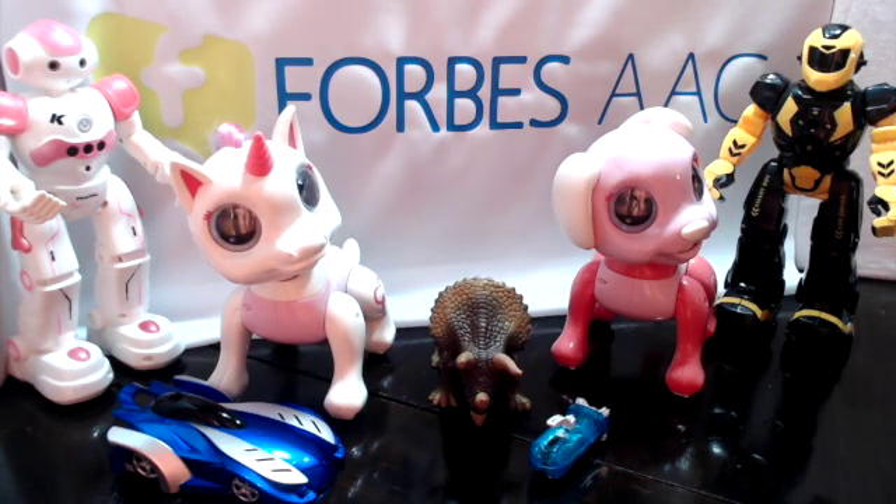Hi, my name is Bridget Gillermini and I'm an Assistive Technology Specialist with Forbes AAC. I want to share with you some of the infrared toys we've been exploring here at Forbes. We've paired the IR commands of the toy actions to grid sets on our new WinSlate, which features an Adapta Hub with built-in infrared. There are other infrared toys you can use with the Forbes WinSlate, but we've tested and created grid sets for each of these toys.